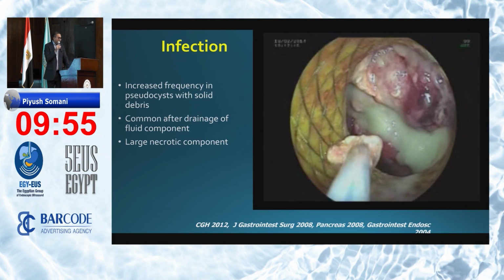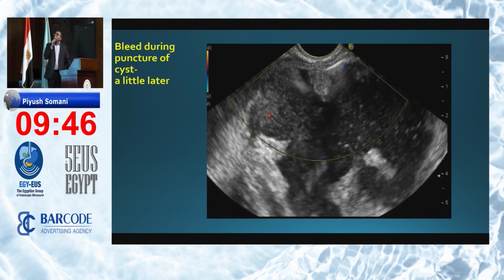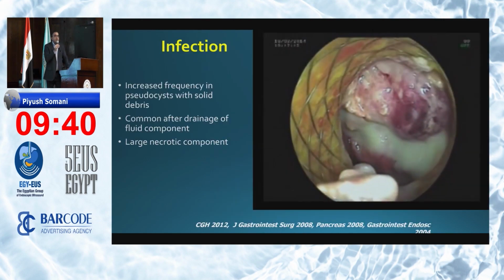This is another video showing a late bleed after the puncture. So again, you can see the bleeding happening, and you can see the hyperechoic blood flowing inside the cyst. Infection is also a complication.